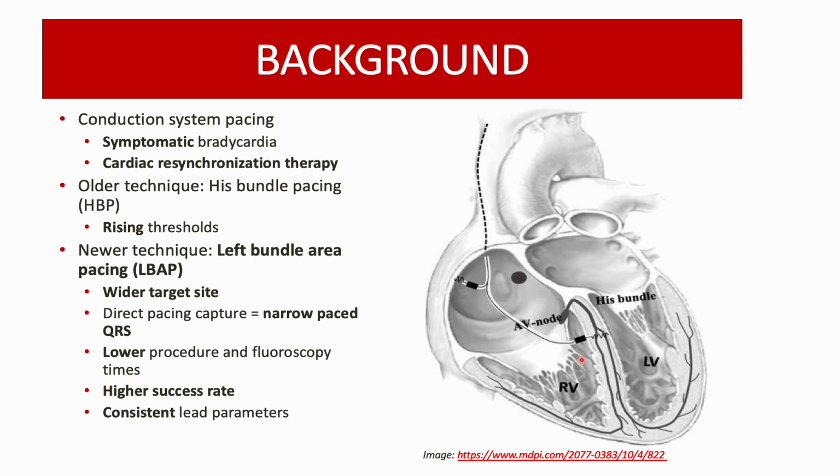The left bundle area is a wide target site which allows for direct pacing capture, resulting in a narrow QRS. The resulting pacing parameters with left bundle area pacing are consistent throughout, unlike the His bundle pacing where there are rises in the threshold.